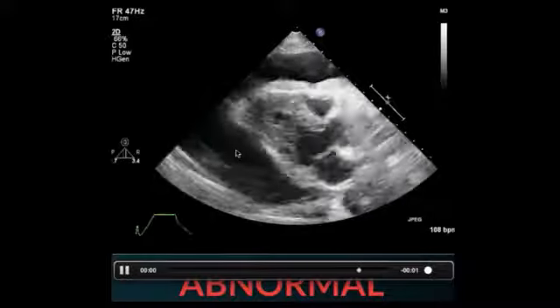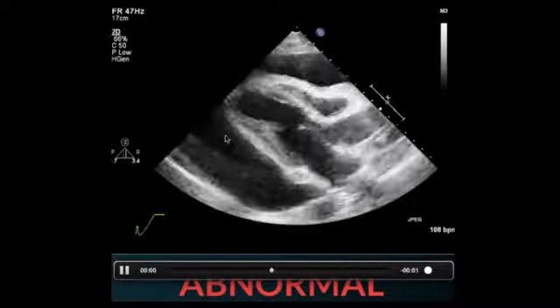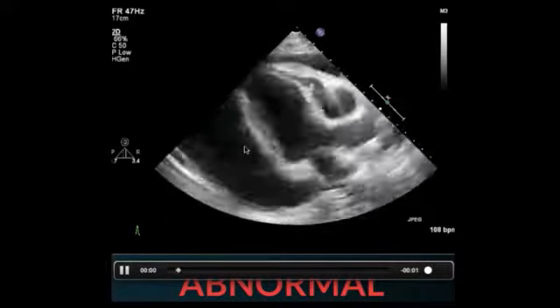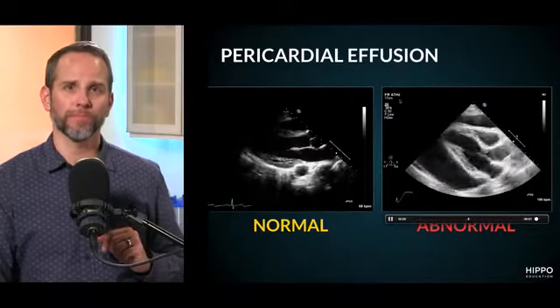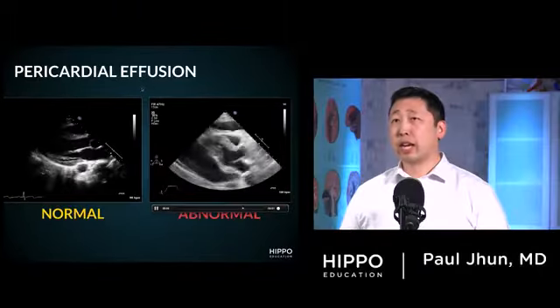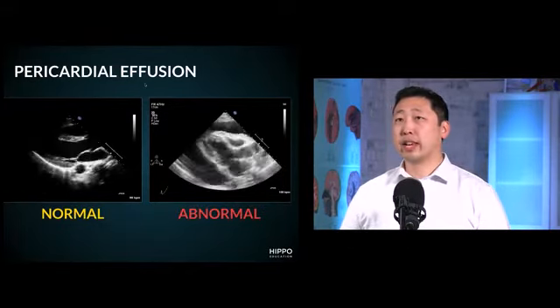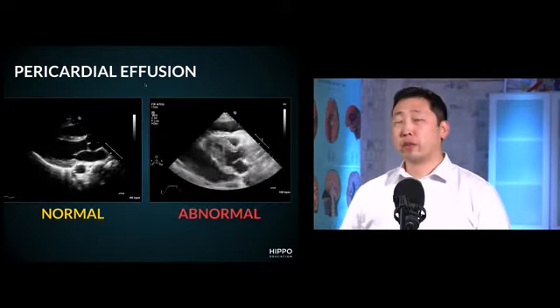That's a pericardial effusion. And if they're in tamponade or hemodynamically unstable, you need to do something about this in terms of getting that fluid out and setting them up for a higher level of care. But the view is pretty straightforward and very easy to do. Just don't forget the descending aorta is going to be your guide. Fluid anterior to that is pericardial effusion; fluid posterior to that, or deeper on the ultrasound, is more suggestive of a pleural effusion.